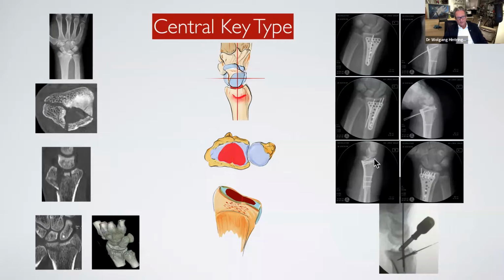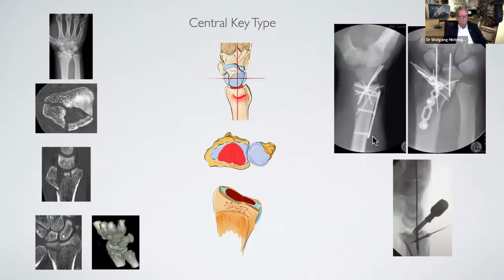That has just to sit on the screws, and then it is stabilized. Also, arthroscopic assistance is here a very good reason.